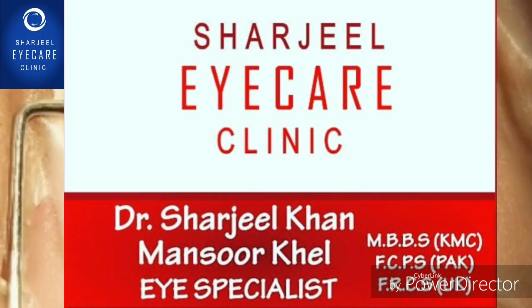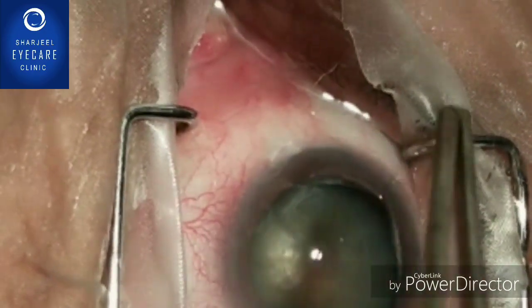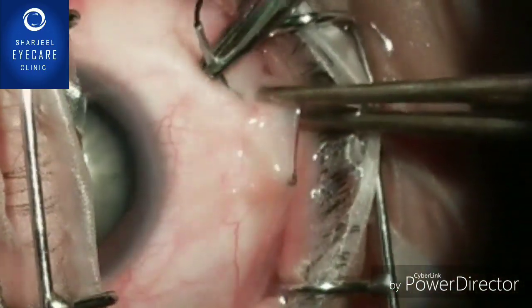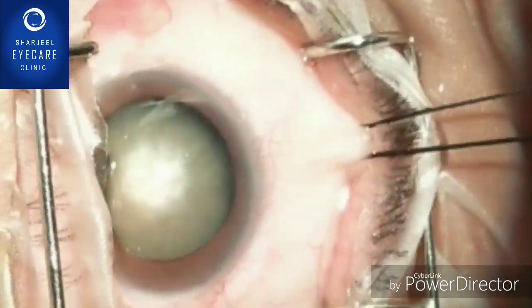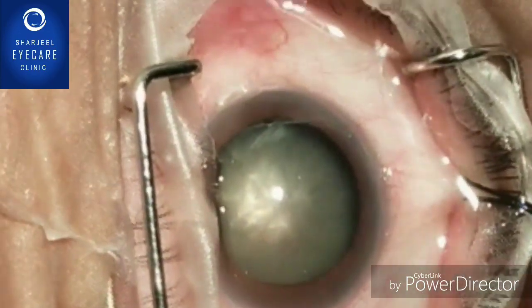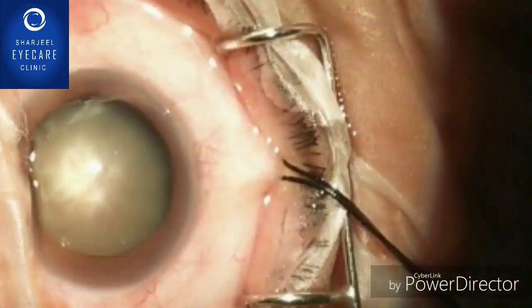Hi, I am Dr. Sharjean and today we would like to show you a very interesting case. This 60-year-old man was struck by a bull horn on the eye. The superior zonules were broken and there is inferior subluxation of the mature cataract. The cataract was brunescent.